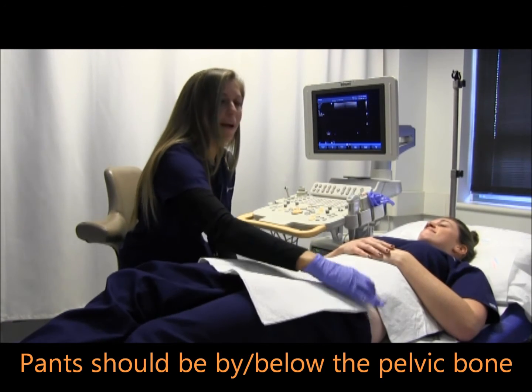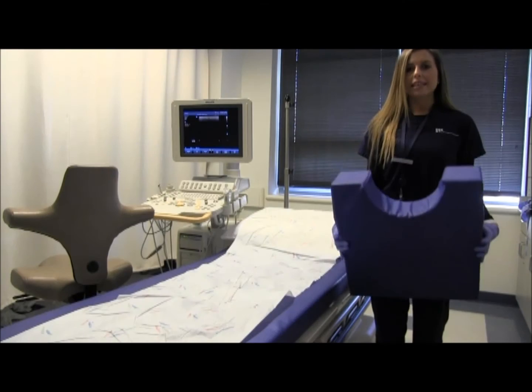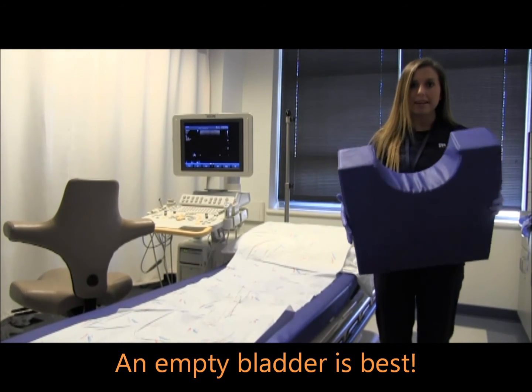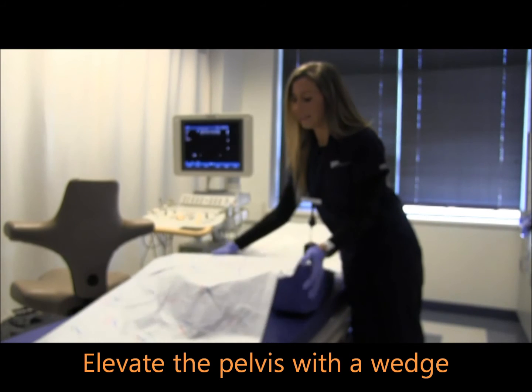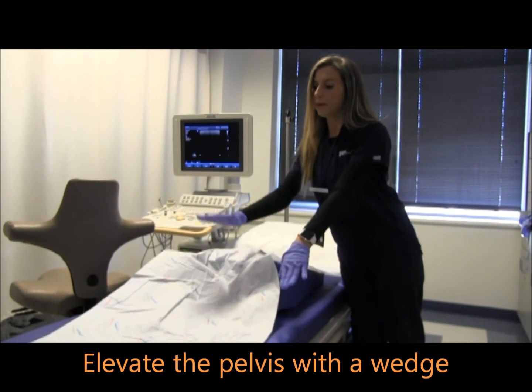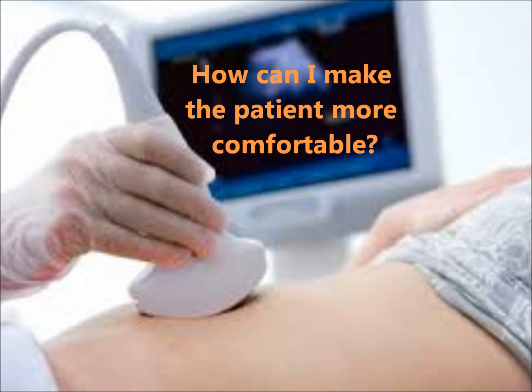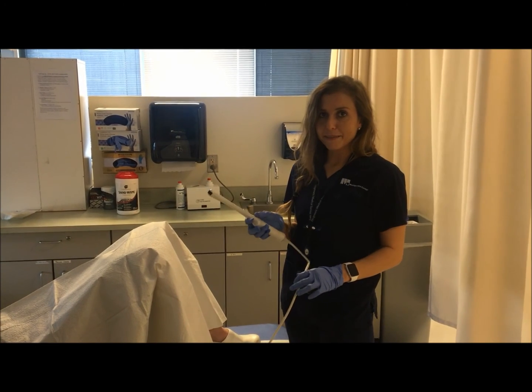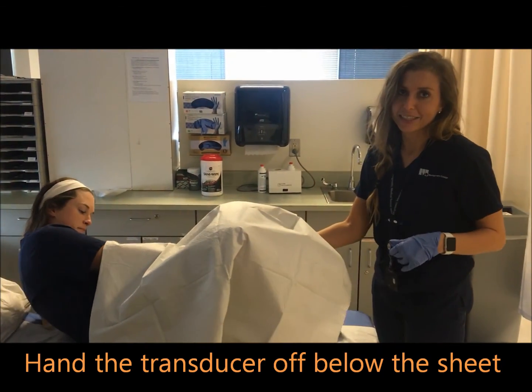For a transvaginal study, ask your patient to empty their bladder, then place a wedge on the bed so that they can elevate their pelvis. Ask them to sit on the edge and drape their legs on each side. For the comfort of the patient, place the transducer under the sheet and have the patient reach under and insert the transducer.